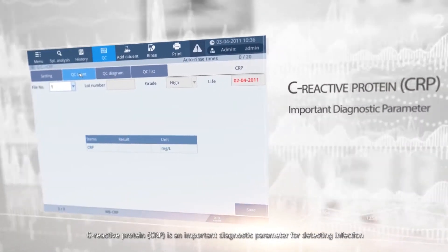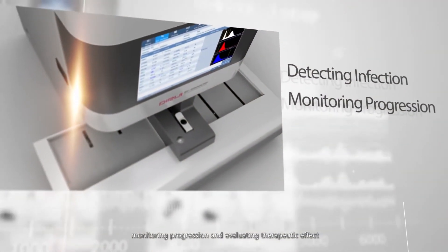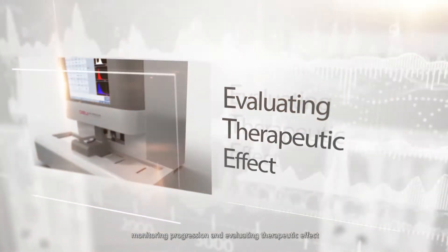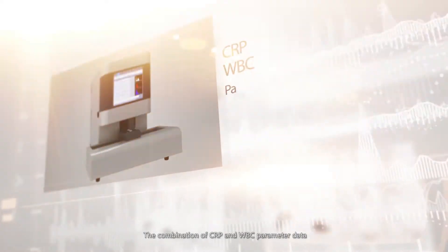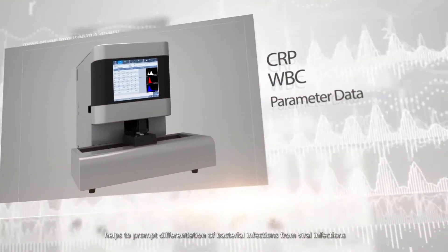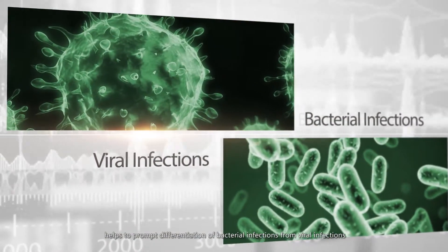C-reactive protein is an important diagnostic parameter for detecting infection, monitoring progression, and evaluating therapeutic effect. The combination of CRP and WBC parameter data helps to prompt differentiation of bacterial infections from viral infections.